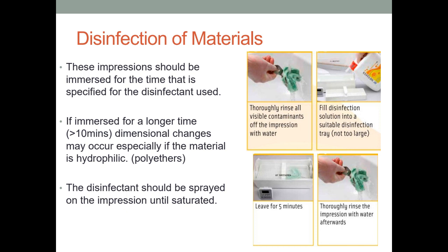The next very important thing to be done for the impression material is disinfection. We are doing disinfection in our clinic also, but it is very important to know which disinfectant is used for a particular type of material. So we have to verify before using the disinfectant. The instructions are given on the material box or the leaflet available in the impression boxes, stating which disinfectant is compatible with that type of impression, and how we can use that particular disinfectant for the disinfection of the material.